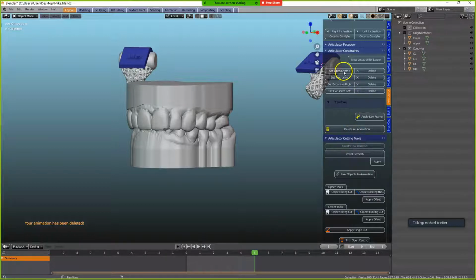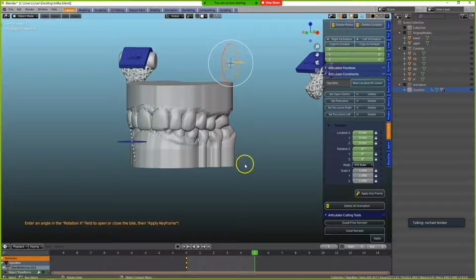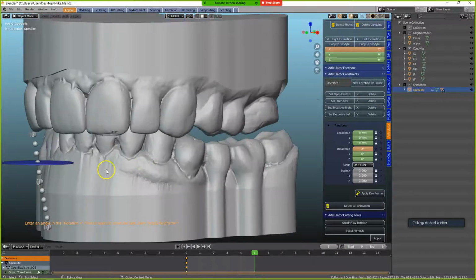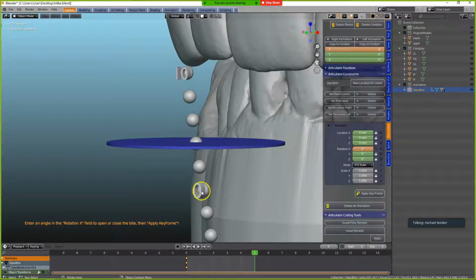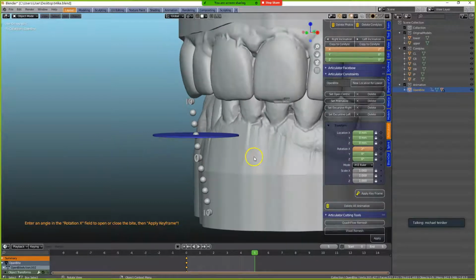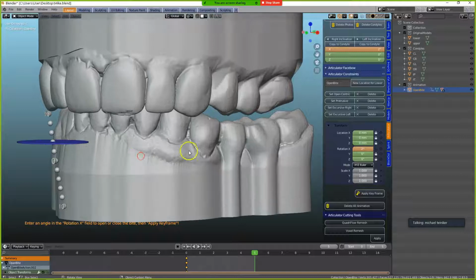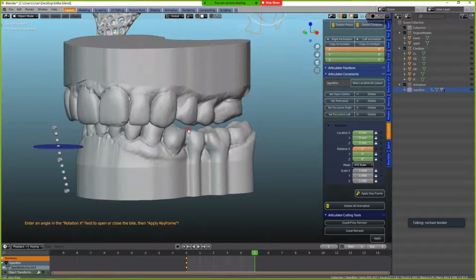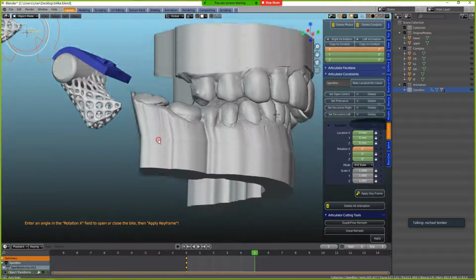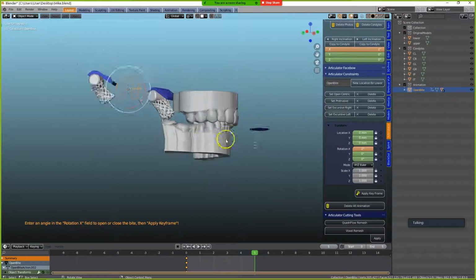I'm going to set the open, and if you said 4 millimeters, that would be 2 degrees of rotation. Because if I put 2 degrees and I look on this little incisal pin, we've got 0, okay, yeah, that's 2 and 4. So we need to see whether we've got enough space to do a splint, and it looks like we have enough space. Yeah, that's good.